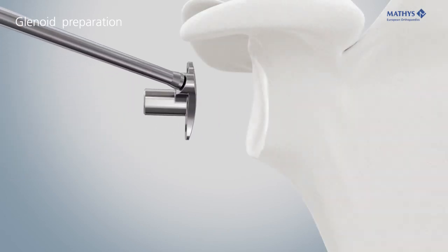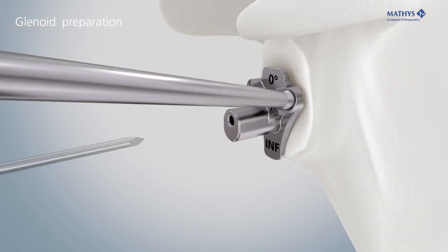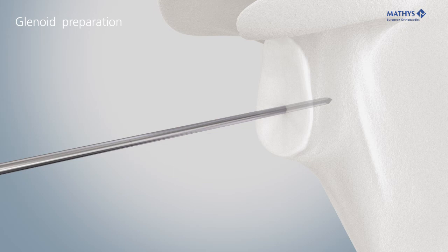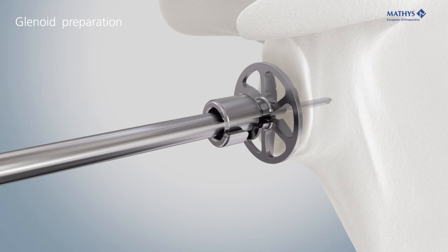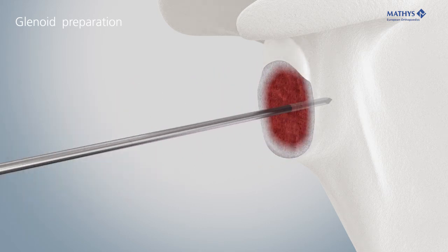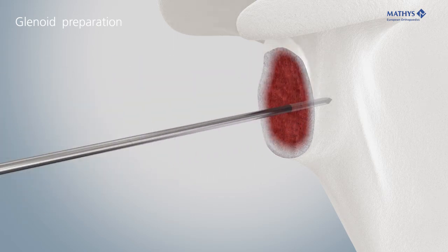Align the K-wire guide with the inferior rim of the glenoid and insert the Kirschner wire. A 0-degree and a 10-degree K-wire guide are available. The modular glenoid reamer is inserted via the Kirschner wire. Ream the glenoid, keeping within the subchondral bone. The glenoid reamer 42 is used to remove osseous protrusions that could otherwise prevent snapping of the glenosphere.